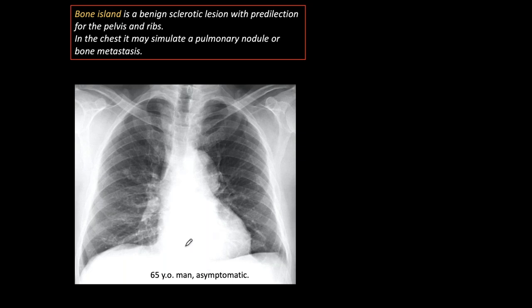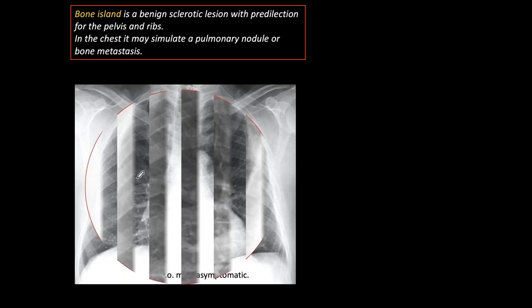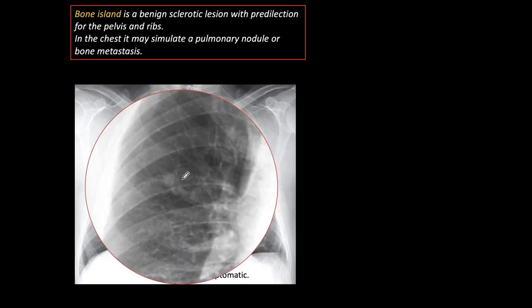Here we have the radiograph of a 65-year-old asymptomatic man. At first glance the chest appears normal, but if we look carefully we see a small nodule there, superimposed over one rib. In the coned-down view it doesn't look calcified and seems slightly irregular, so obviously a CT has to be done.